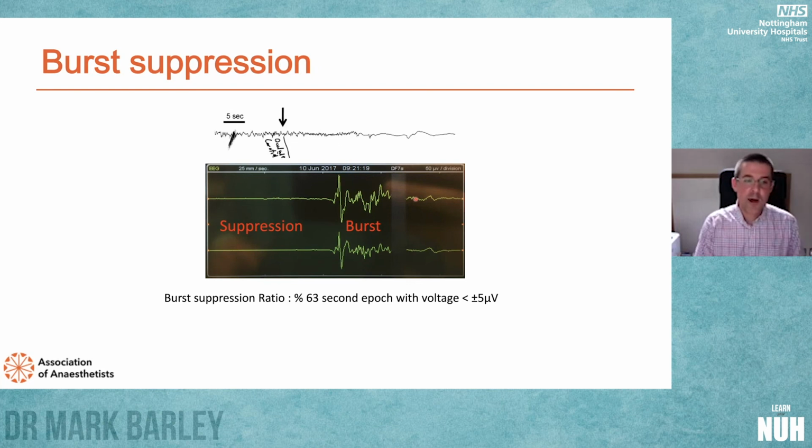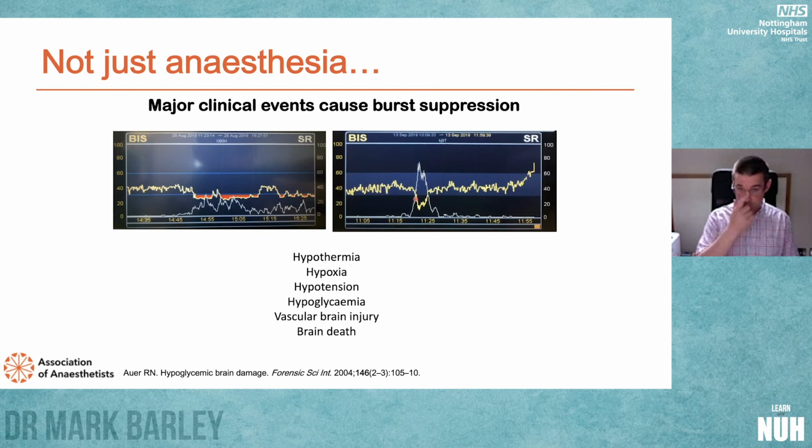It's not just our anaesthetics that can cause burst suppression, but significant intraoperative mischief can cause burst suppression too. This is a patient who suffers a 3.5 litre hemorrhage during liver surgery. You can see the BIS value fall as the suppression ratio starts to climb. There's a period of restoration of blood pressure here where the BIS value climbs and the burst suppression sinks a little bit, before a little bit more bleeding before the situation is all resolved.